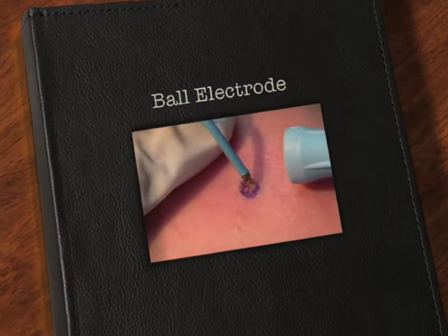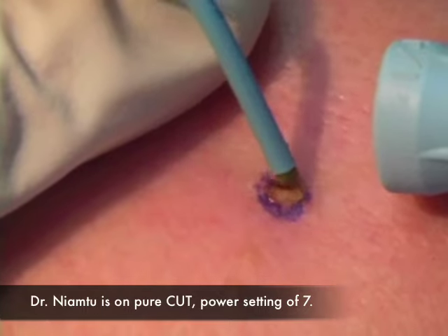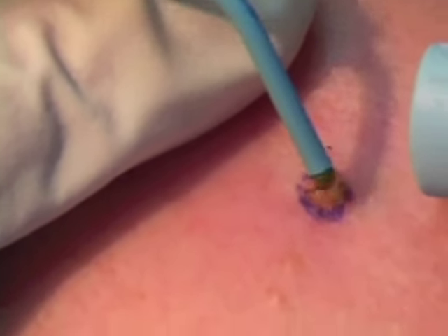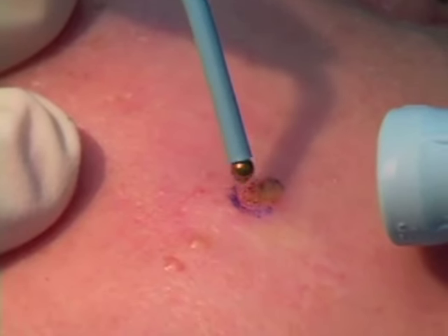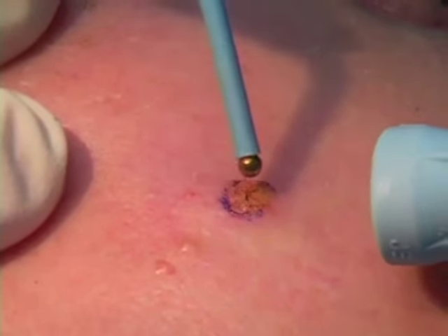A setting of seven, and what we're doing is just — you feeling that a little bit? Mm-hmm. Okay. Can you tolerate that? Mm-hmm. And your contact should be very brief. You don't want to channel excessive heat through the skin.